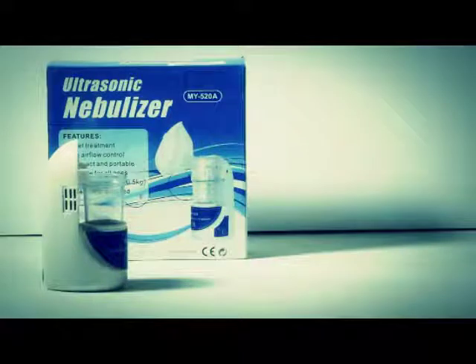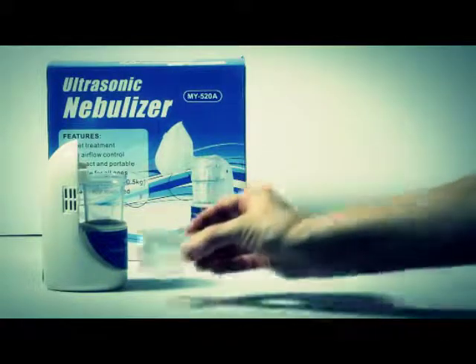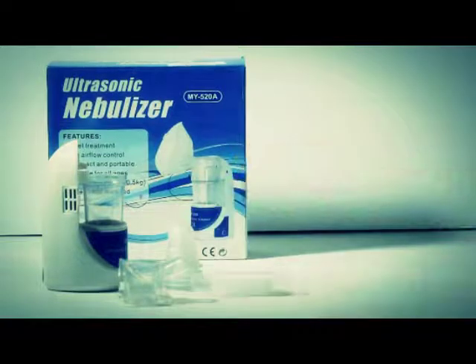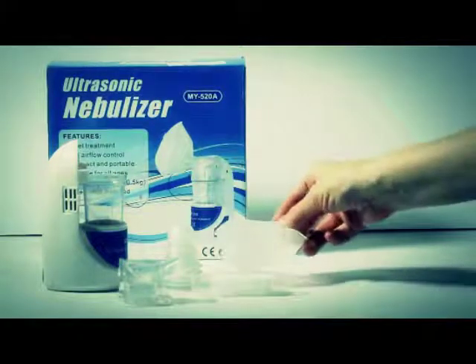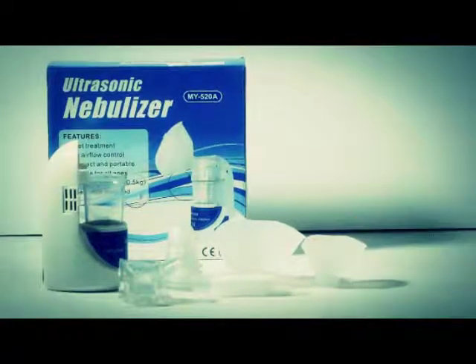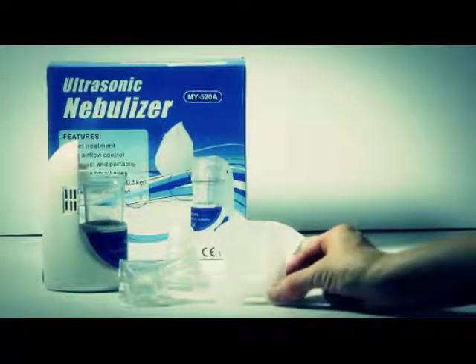What's included in the box? The unit, a stack of medicine cups, two face masks — one for adults and one for children — and two mouthpieces.